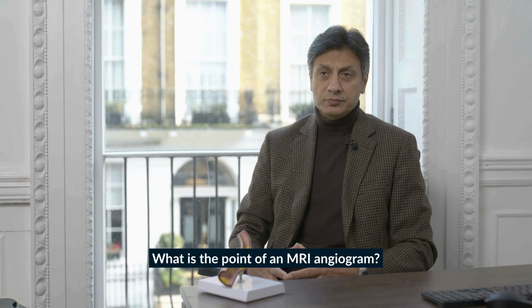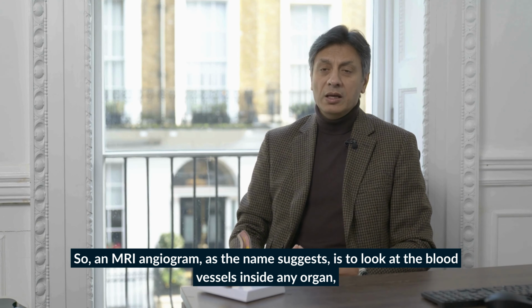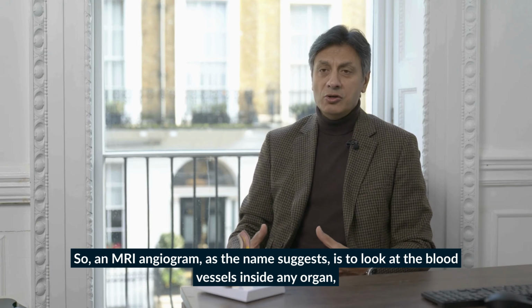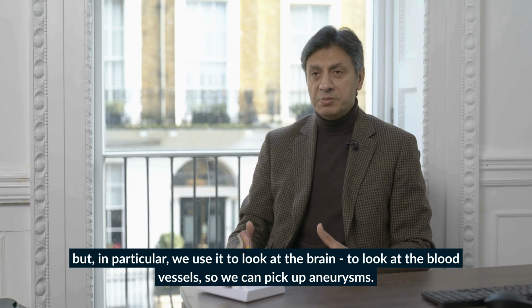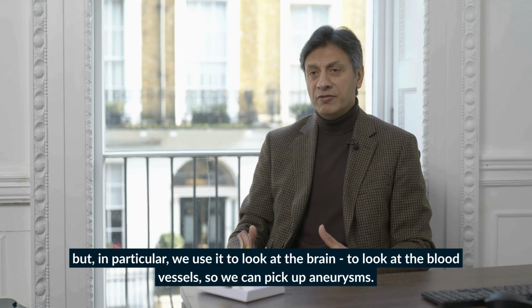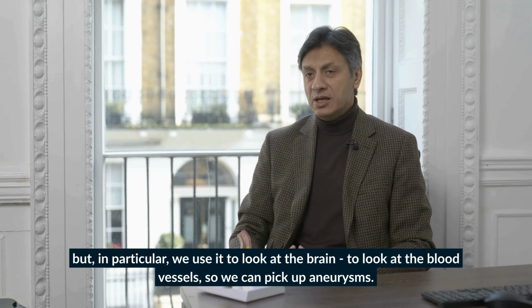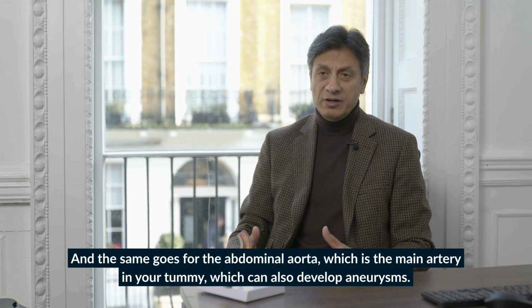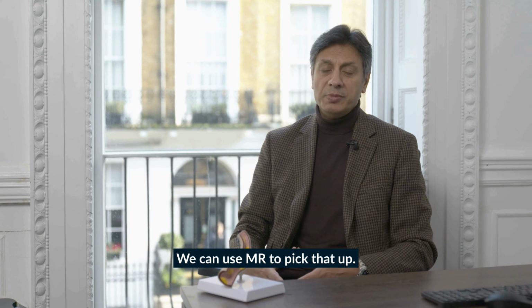What is the point of an MRI angiogram? So an MRI angiogram, as the name suggests, is to look at the blood vessels inside any organ. But in particular, we use that to look at the brain, to look at the blood vessels so we can pick up aneurysms. And the same goes for abdominal aorta, which is a main artery in your tummy, which also develops aneurysms. We can use MR to pick that up.